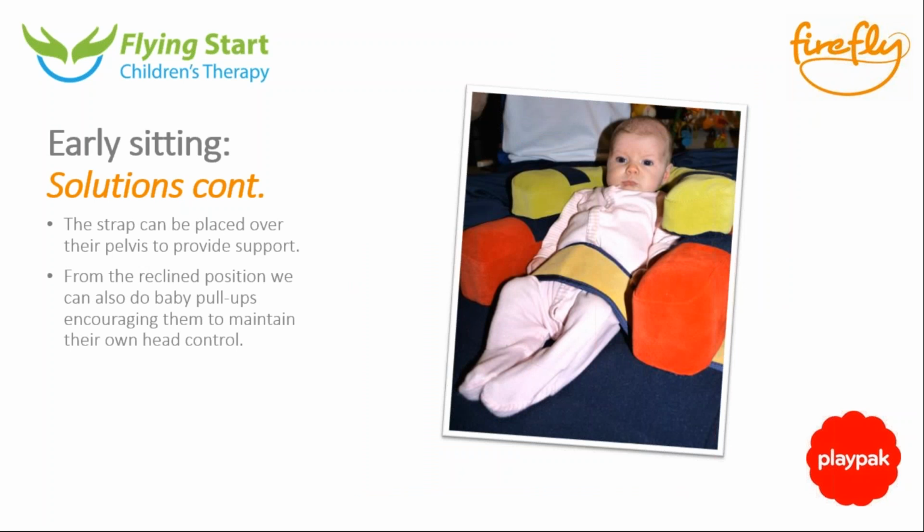So to support baby in the sitting position, we can use either one or two straps. The girl pictured here is only little, so she just needed the one strap in front of the pelvis. But if she was a little bit bigger, I would remove the roll at the back of the horseshoe, slide her bottom back, use one strap over the pelvis, and then probably get another strap to help keep her body up and in a more sitting position as opposed to really flexed forwards. Saying that, at times you would want to remove that top strap so that she can actually flex forwards and reach for the floor.